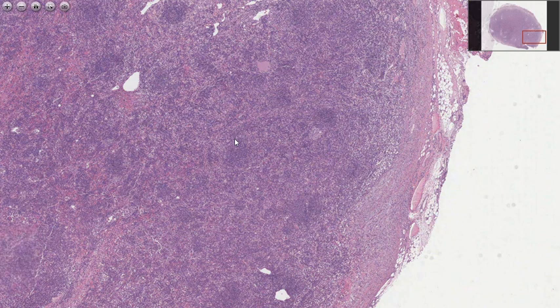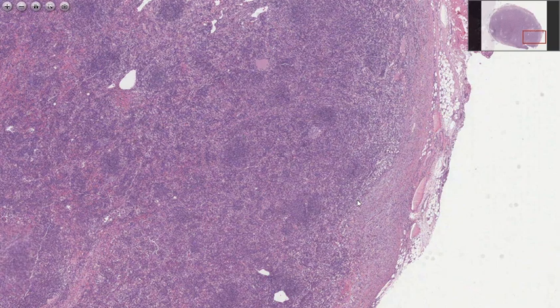higher magnification, and I'm thinking whether this could be dermatopathic lymphadenopathy or something like that. Yes, I don't remember the real terminology here. And another thing is thinking about toxoplasmosis or something like that. But who knows? Let's find out what it is.